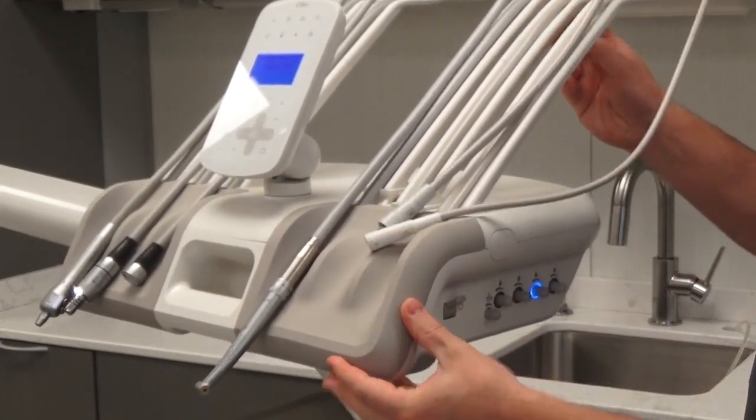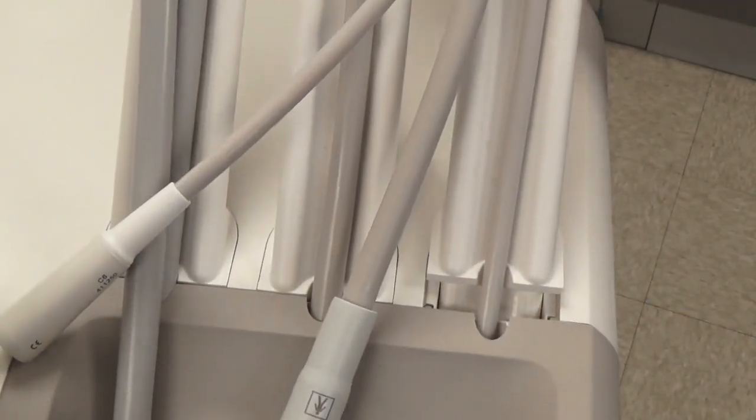Once you've done that, you just push the whip arms back, making sure that they're covering the tabs, and you're done.